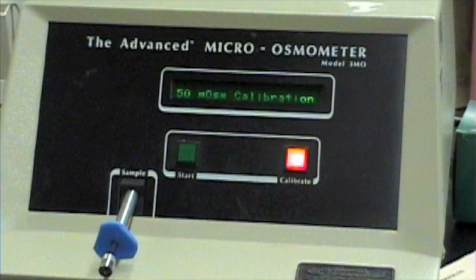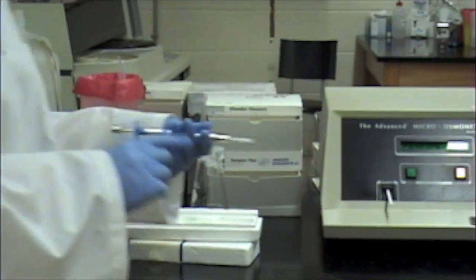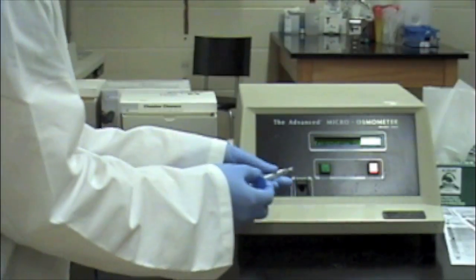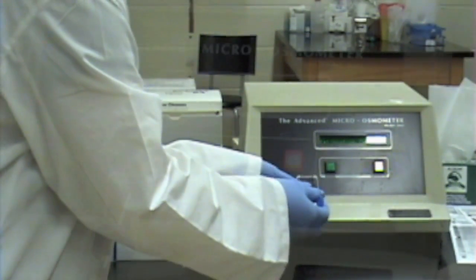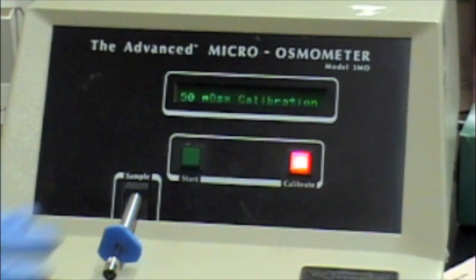To begin calibration, press the calibrate button. The display should show 50 milliosmol per kilogram calibration. Remove the chamber cleaner from the sample port and insert the sampler, making sure not to inject the sample into the instrument. Press the start button. Do not remove the sampler until the test is complete.